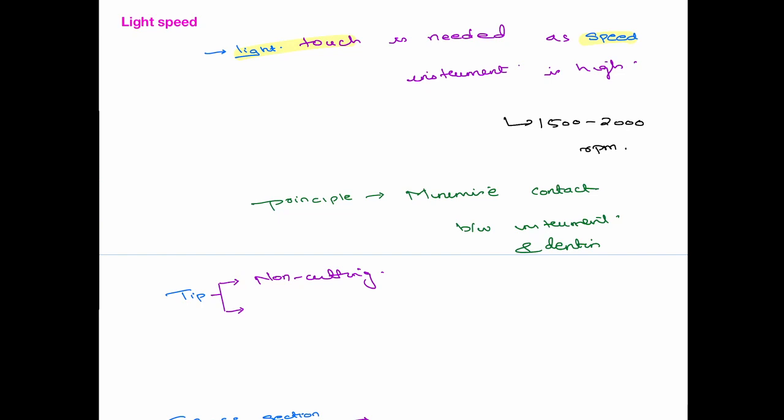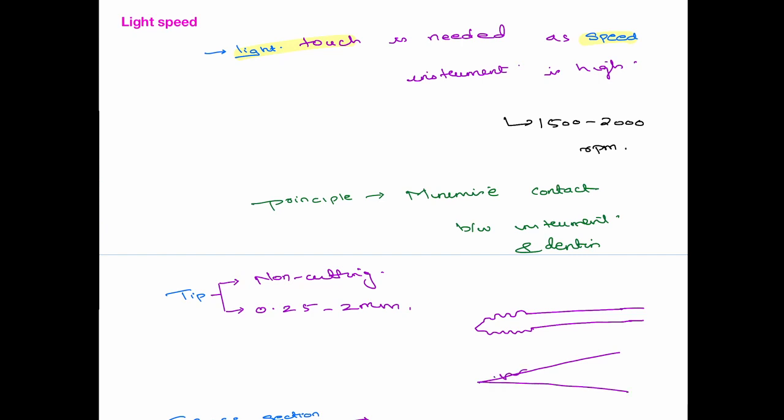Very interestingly, the tip length is 0.25. Not tip diameter, tip length. You have some cutting edges here, and the rest is just straight without any taper. Usually, you have a taper like this and the entire 16 mm is cutting.